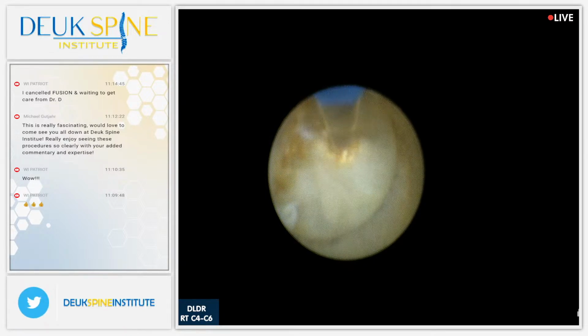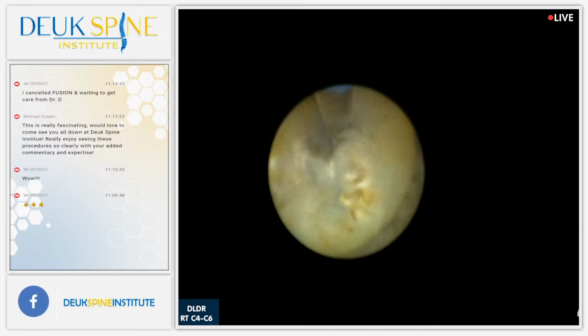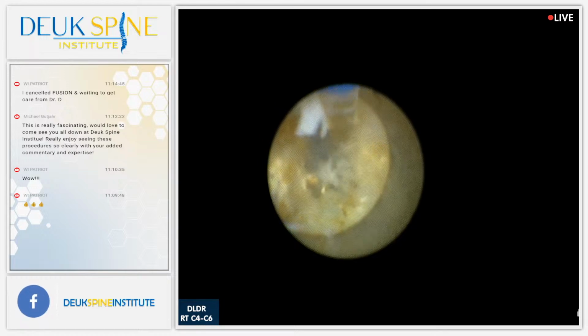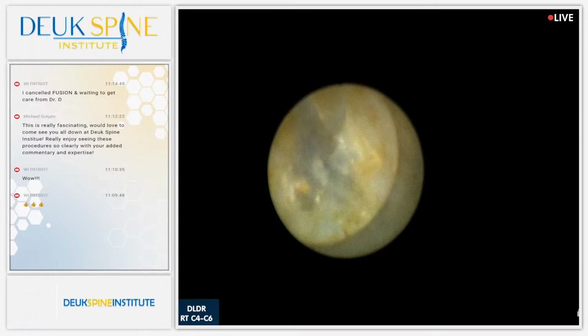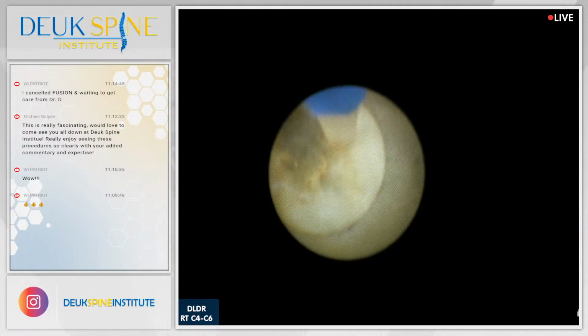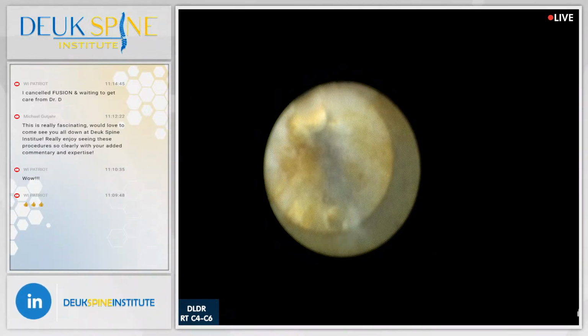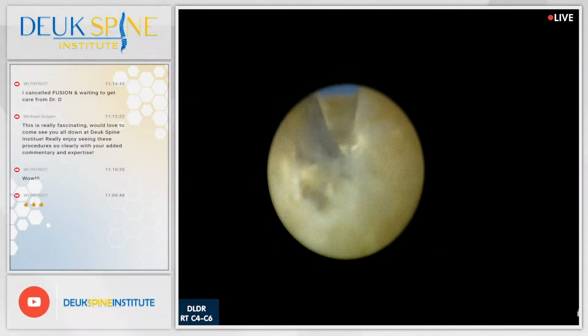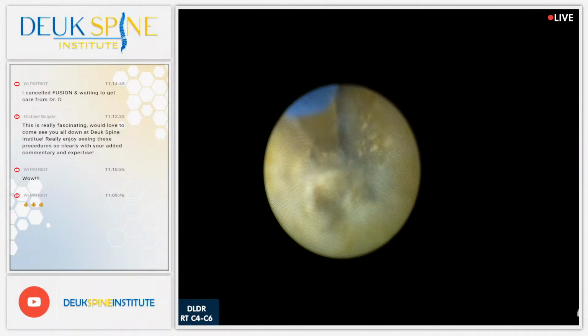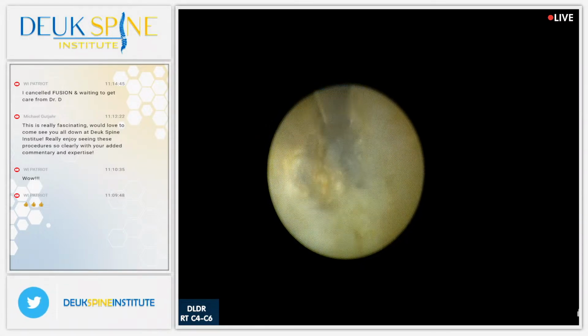All right, it's like a rock, a granite rock, and channeling a river between it. Now, if there wasn't as much scar tissue in the back here, then the dye would diffuse into the tear more unevenly, and you would see the tear better. But with the granite face of the cliffs channeling the dye out the foramen and the epidural space, you don't see much, and that's why.